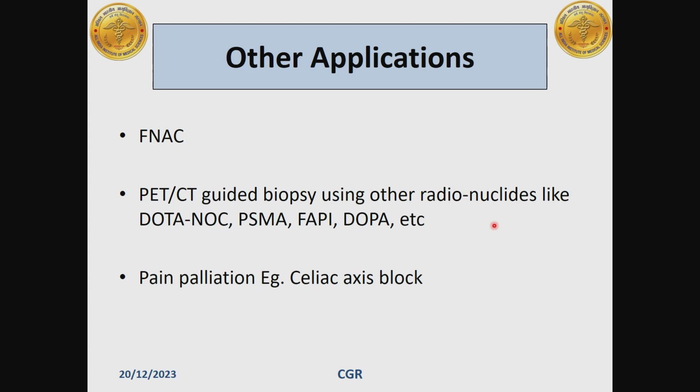We would also like to extend the utility of this robotic arm to CT-guided procedures like pain palliation. Though there is no PET component associated with this procedure, this robotic arm can always be utilized for pain palliation because of its high precision.